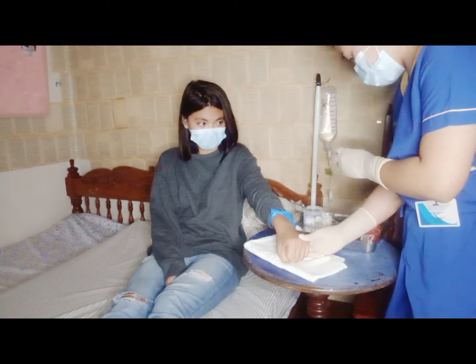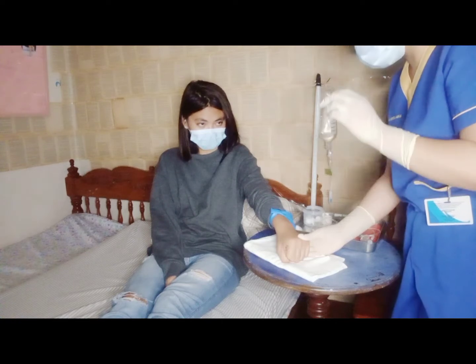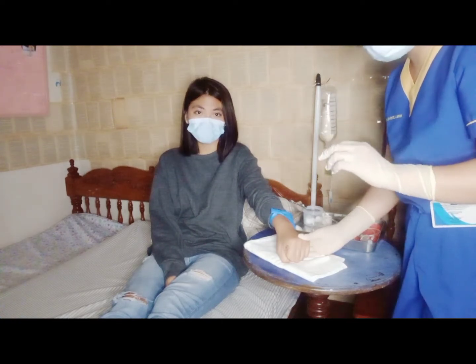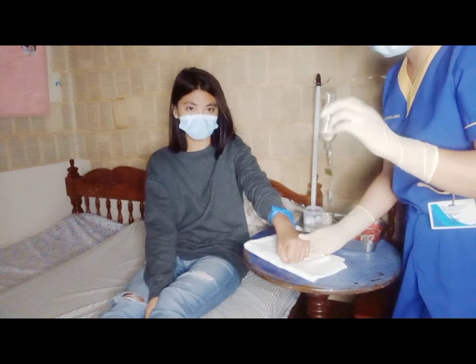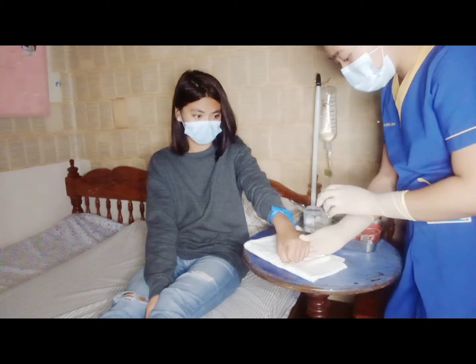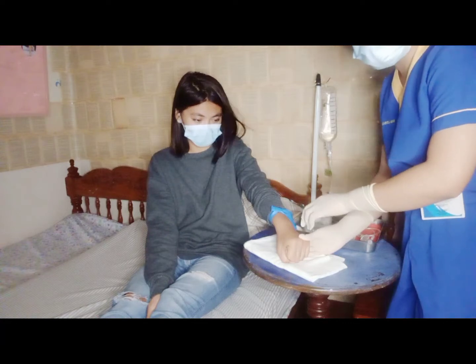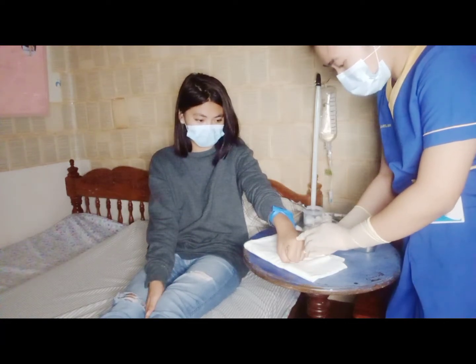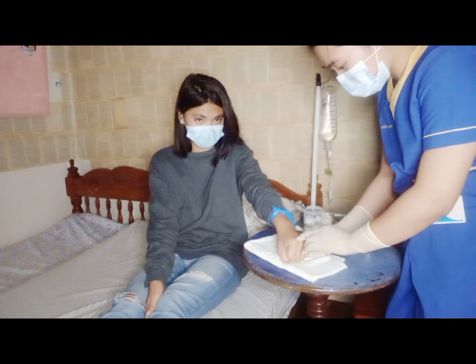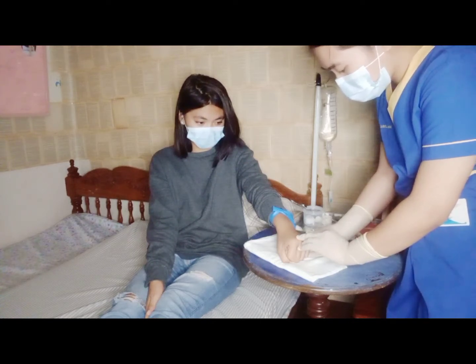Remove lang natin yung cup. Okay. So, for the insertion of the catheter, the bevel of the needle should face upward. And for the first insertion, the catheter should be at 45 degrees. Okay. Then, if we insert it, the catheter should be at 10 to 15 degrees.